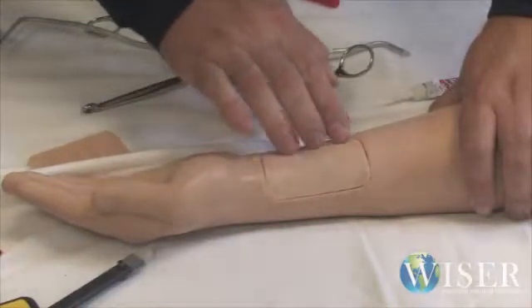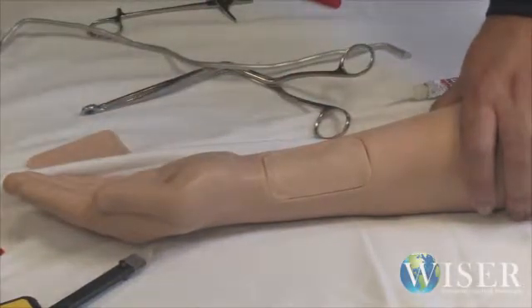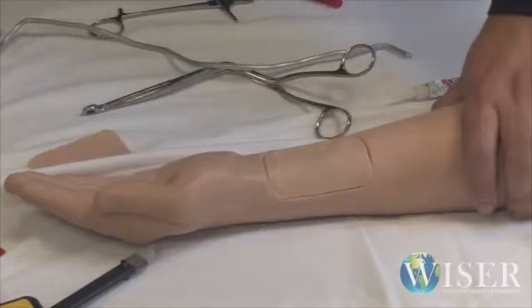And once your skin's back in place, you remove your clamps, we're back in business, good as new. Your pulse has been replaced.